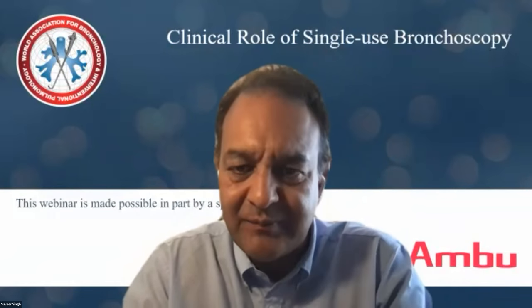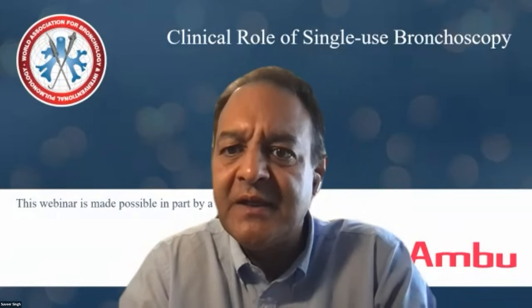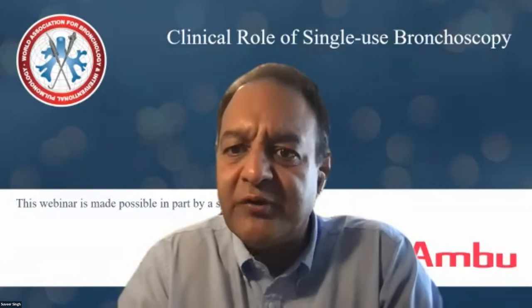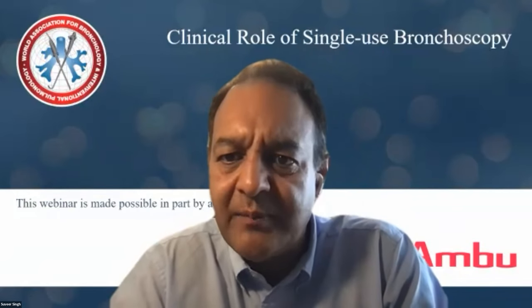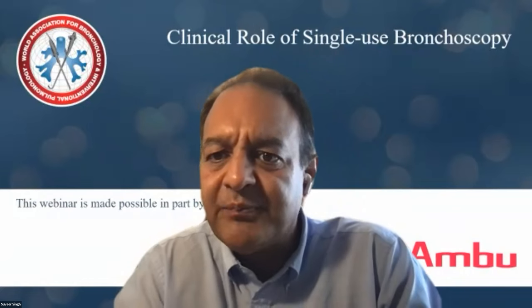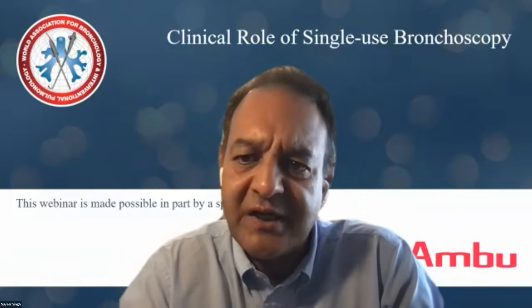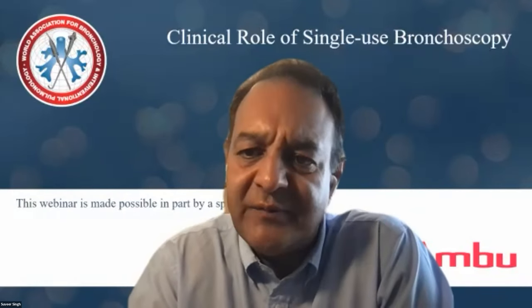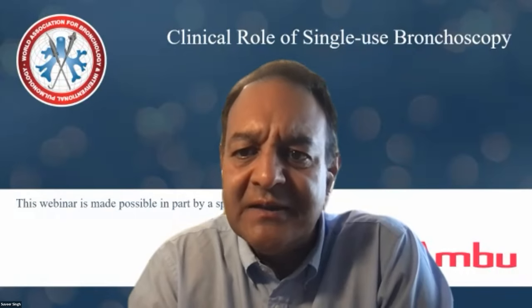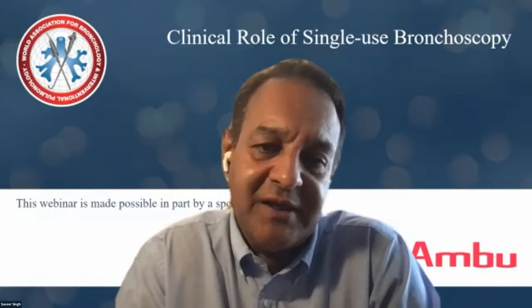We have some questions here. One of the questions was from Singapore, the University Hospital, from a respiratory therapist, Billy Garosp. Most of my consultants prefer to use reusables because of stronger suctioning and good graphics, suggesting that the angle is different from the Ambu in terms of viewing angle. Any improvements? I would say yes to all of those.